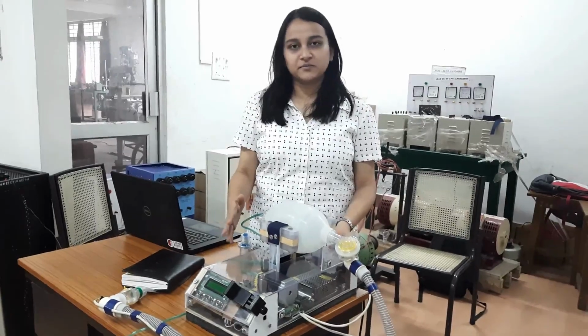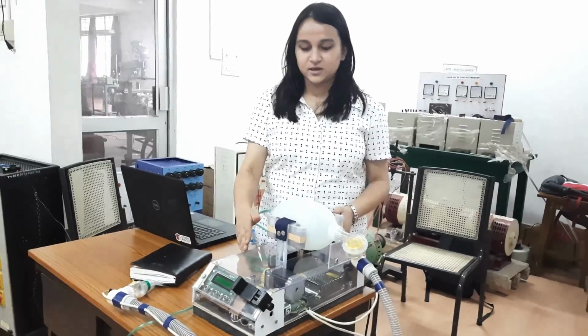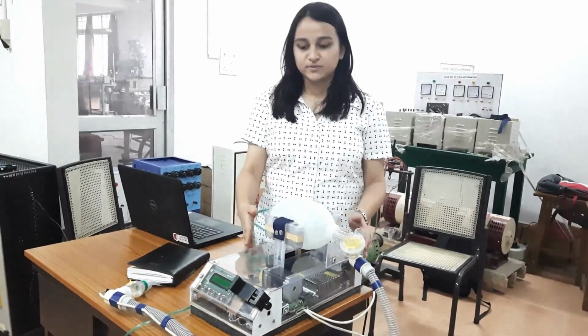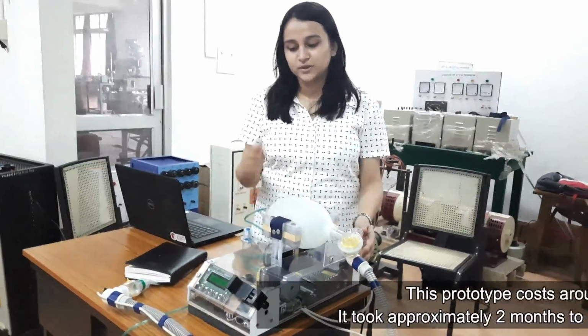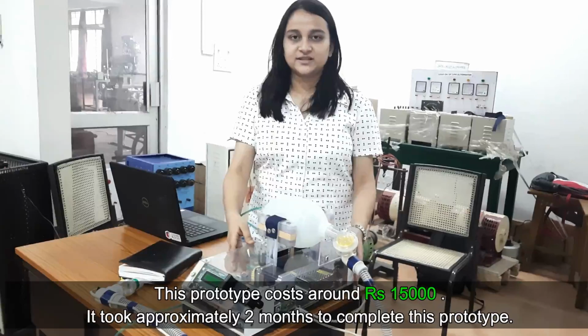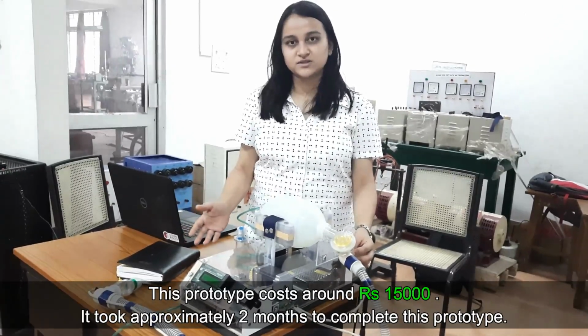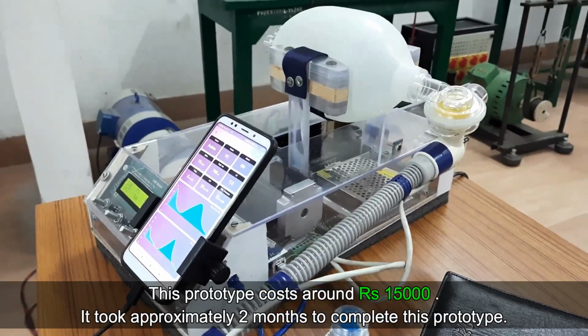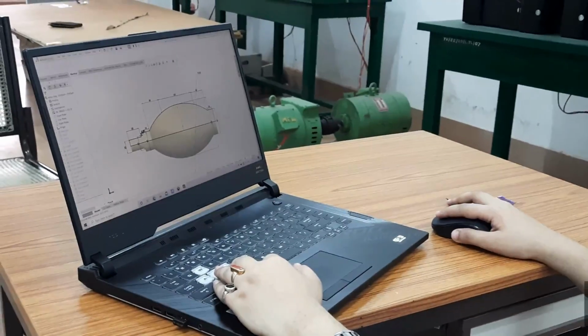The number of ventilators present in the hospitals is very small in comparison to the patients in the ICU. So this model presents the design of a low-cost portable mechanical ventilator equipped with Bluetooth technology, which we can control and also monitor the ventilatory parameters through mobile phone, laptop, computers, etc. It is also low cost, compact, lightweight, and thus portable.